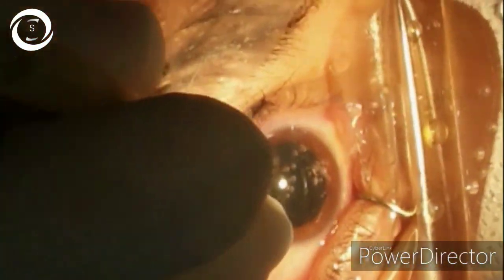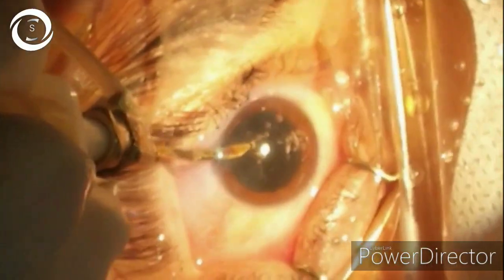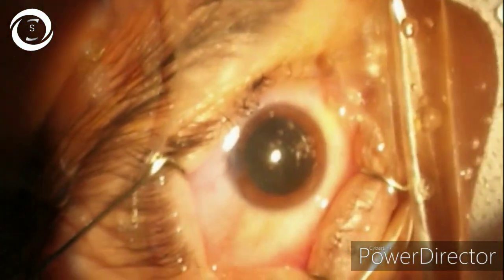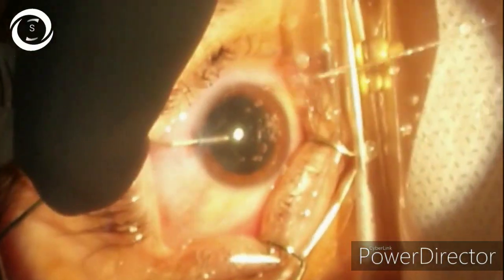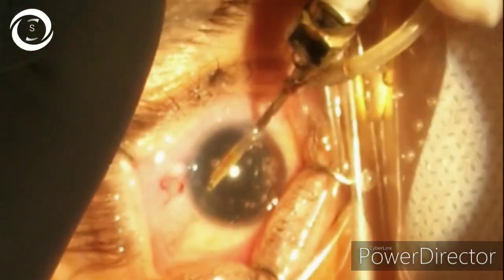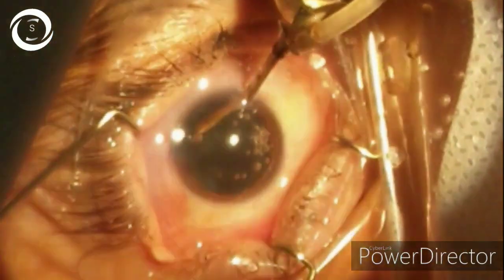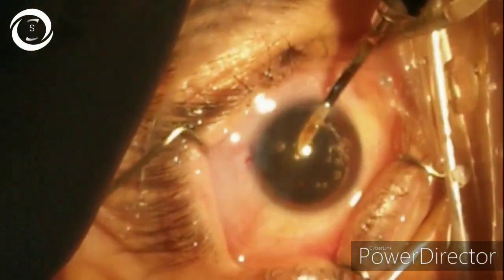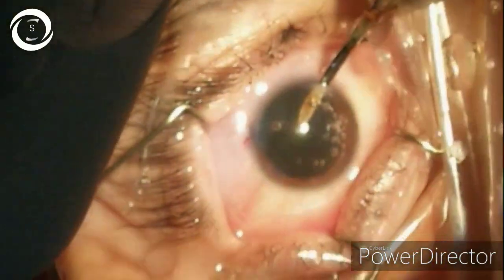The lens was very soft in this patient, so all the lens matter was aspirated with the irrigation-aspiration cannula. We had a phaco machine well prepared, but the lens was very soft so we did not require it. The red glow was not good because of chorioretinal degenerations. Very gently we are aspirating the lens matter.